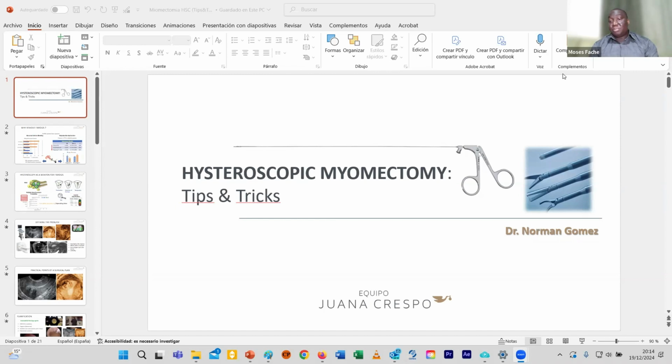It has helped people with less skill to downgrade a type 2 submucous fibroid to type 1, sometimes type 0. They do not remove the pseudocapsule, come back in 2 months' time, and then try to resect it. That is what some of us who want to dive deeper into difficult myomectomies do. However, FIGO type 3 has been a challenge.